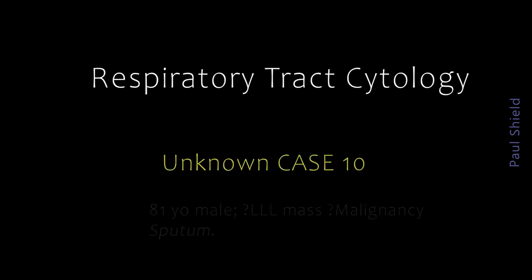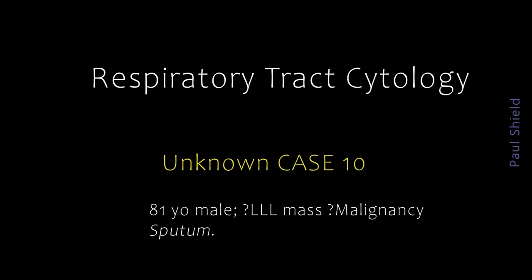Hi, it's Paul. This is another sputum specimen, and this one is on an 81-year-old male who had a known left lower lobe mass. Have a look at it.